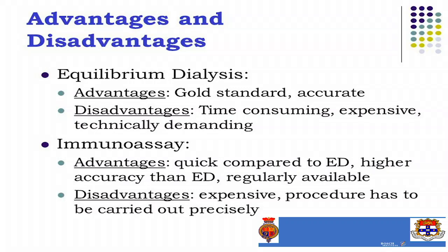I don't think it's fair to say that in America we only use the total. A lot of reflexive strategies actually have free built into them, and we do listen to the rest of the world, not always, but I would say that we do measure total, how necessary or unnecessary it is, but I agree with you. What are we wasting, and what is the best biomarker of outcome? I think we really do need to get there, and I agree with you.